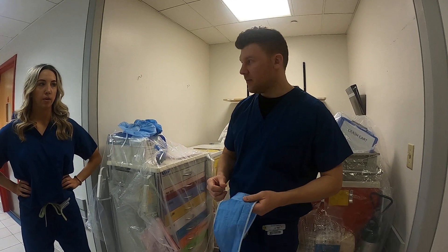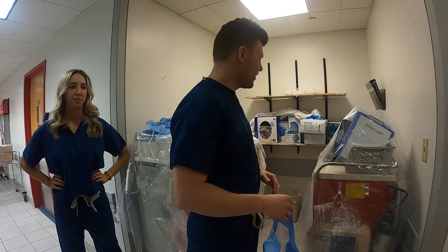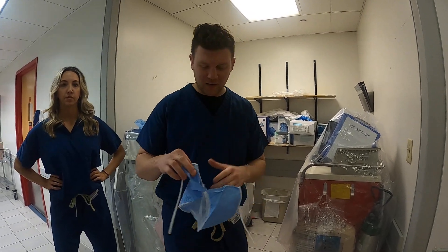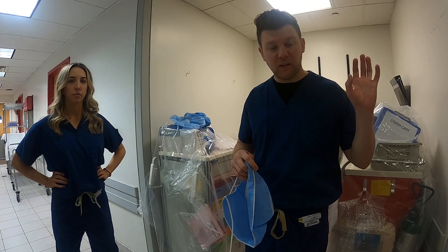Good morning. Hello, this is intro to scrubbing into surgery. We are at quarantine time, so everything's covered up here. But we're going to go through and show some steps on how to even get into the case first.